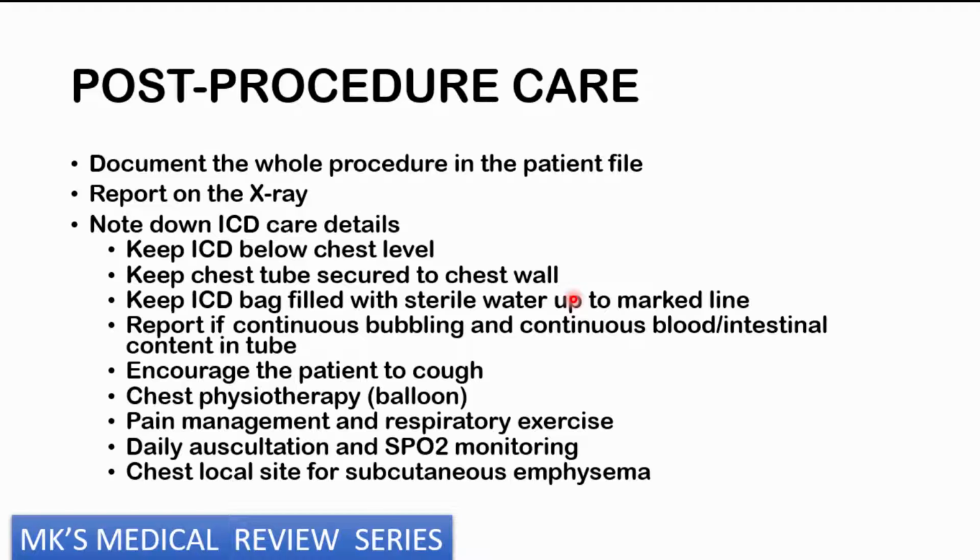Then you should encourage the patient to keep coughing and have some chest physio. So give this patient a balloon that they're going to be inflating intermittently so that their lungs can inflate and deflate to help with the drainage of the fluid or the air in the pleural space. Because remember, as someone expires, the pressure in the pleural space increases.